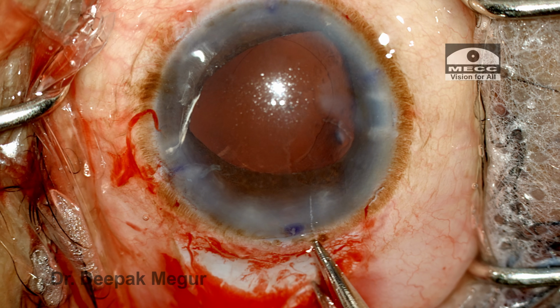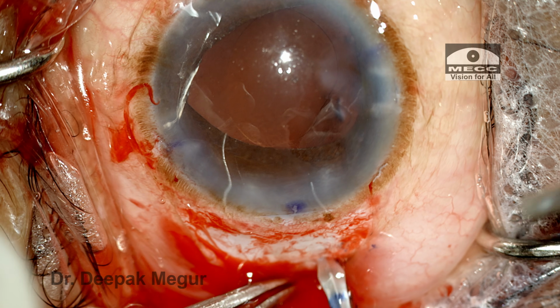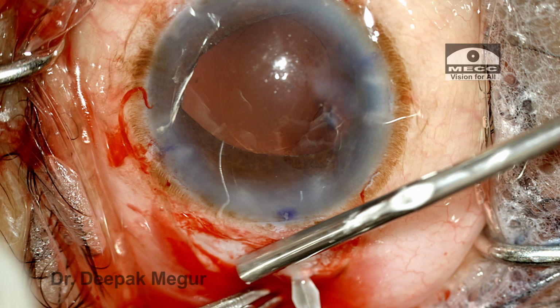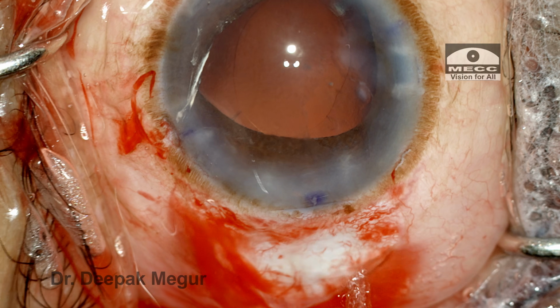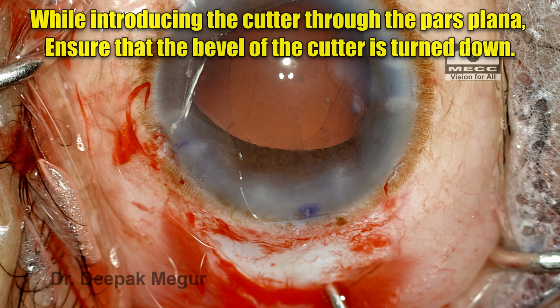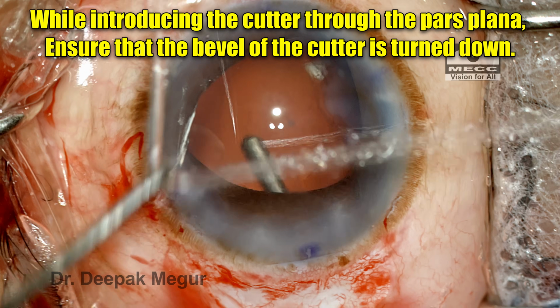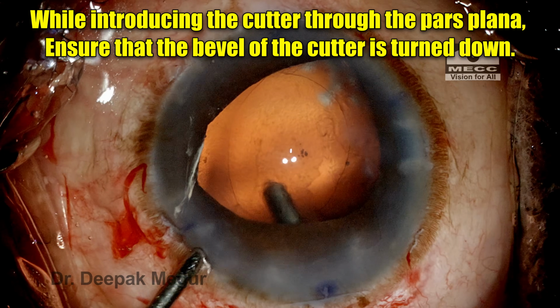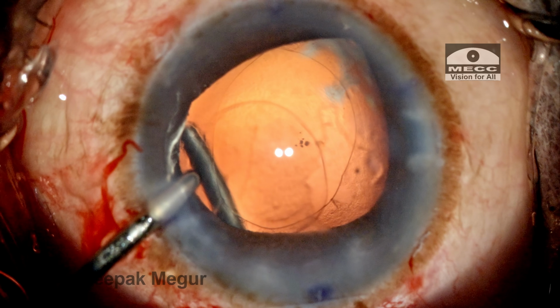3 mm from the limbus, an MVR blade is used to create a sclerotomy port. This port is created by directing the blade directly towards the midvitreous cavity, and now is the time to perform the vitrectomy. So as I'm introducing the cutter, it is important for us to realize that the bevel has to be down when I'm entering the eye, and always directed posteriorly towards the midvitreous.